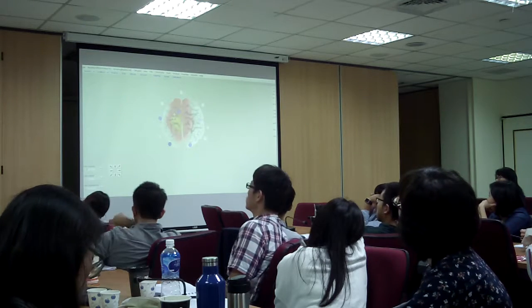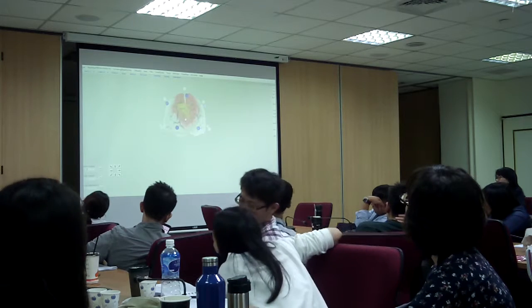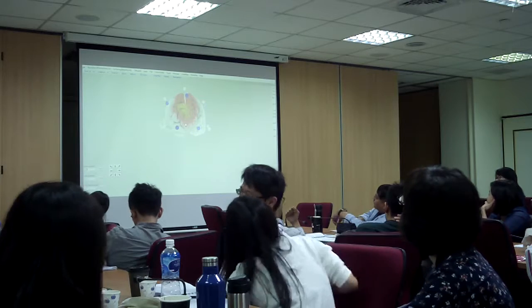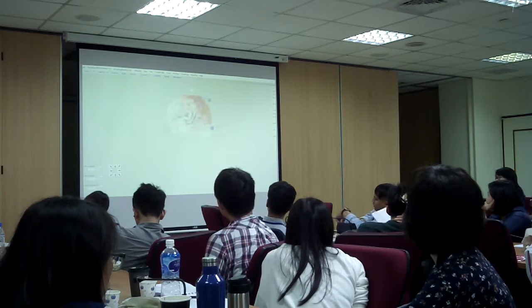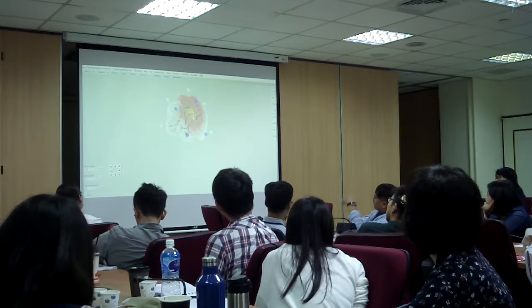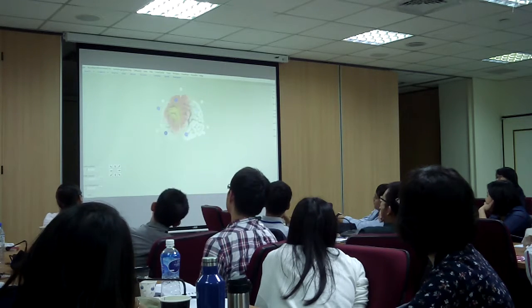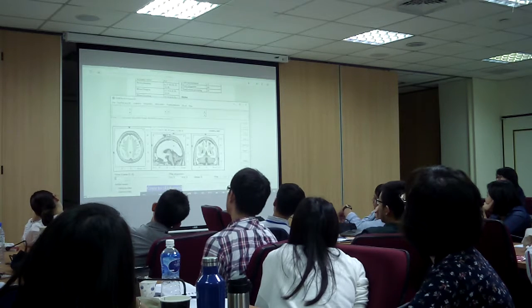So integration, self-regulation, we need to train that. And you saw that the amplitudes were higher in the back of the head. Remember that? So this is an area of interest to train as well. So you could do some occipital training. This helps you further assess where you would need to do the training and where you think it would be more successful.